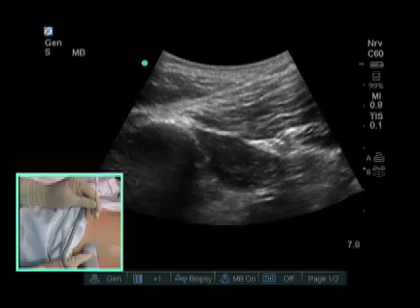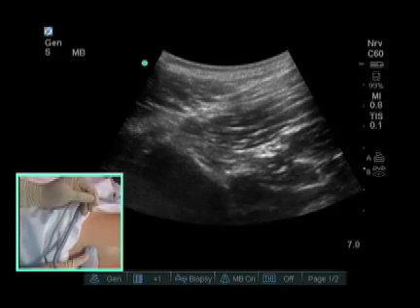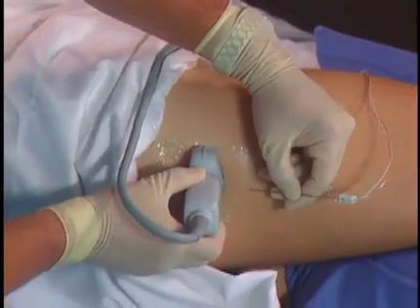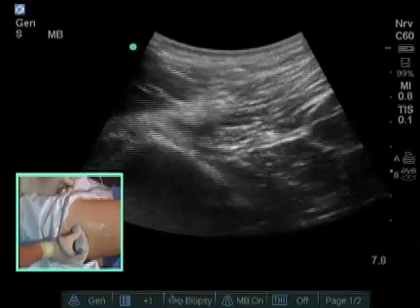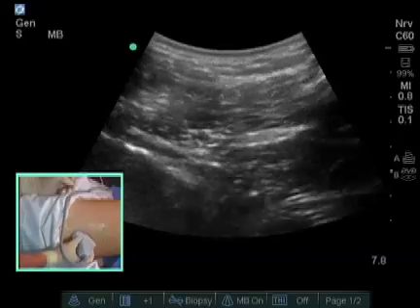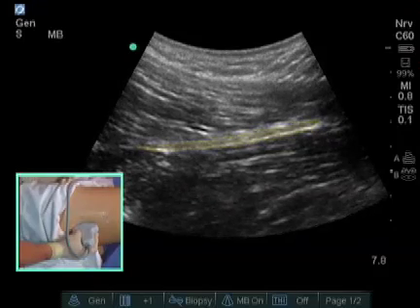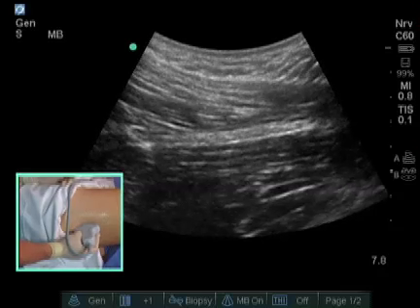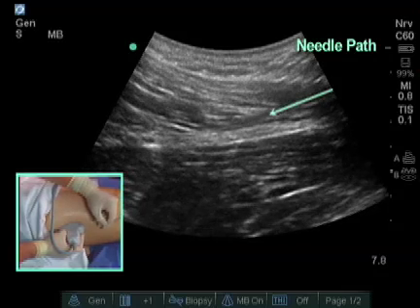Typical volumes are 20 to 30 milliliters of local anesthetic. Because this nerve is so deep in some people, some anesthesiologists like to approach it from an out-of-plane needle angle, in the direction of the sciatic nerve. Others like to turn the probe in a longitudinal direction and see the nerve in long axis, following the nerve in a longitudinal pattern. The needle approach in this orientation would be in-plane of the ultrasound beam down to the sciatic nerve.